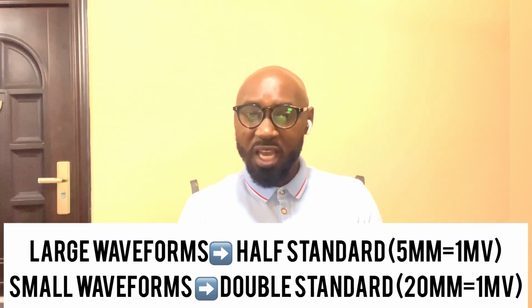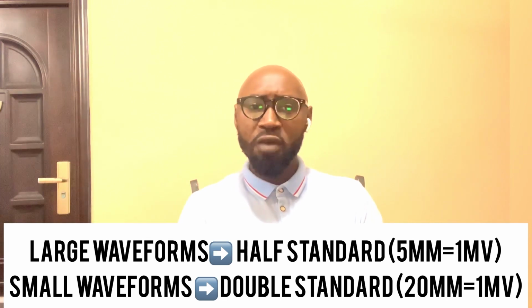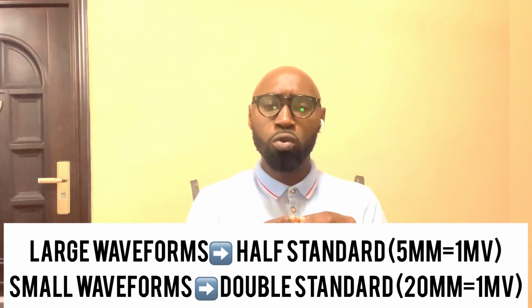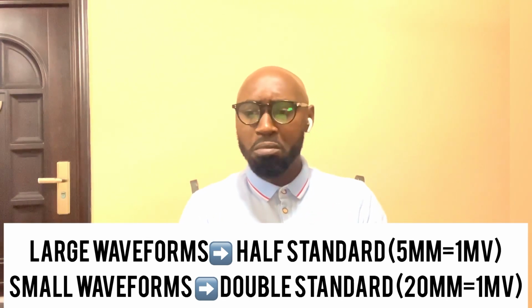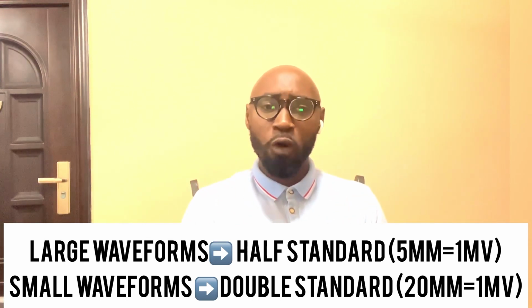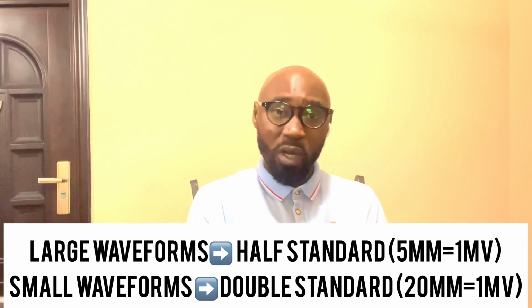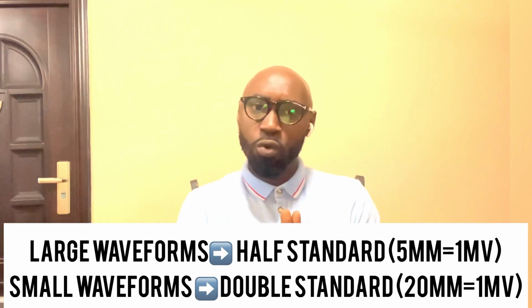In the same vein, it is also possible to increase the voltage. For example, when the waveforms appear too small, we can say use a double standard of 20 millimeters being equal to 1 millivolt instead of the normal standard of 10 being equal to 1 millivolt.